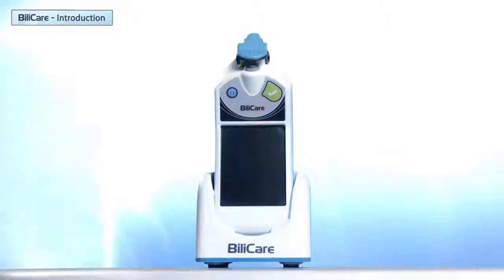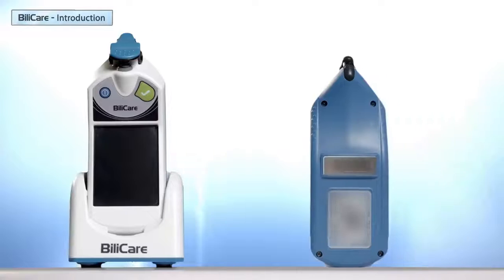Let's briefly go through the different elements of the handheld unit: sensor clip, color touch screen, the on/off button, measure button. On the back are the barcode scanner and Bilicare's label. On the bottom are the connector pads.